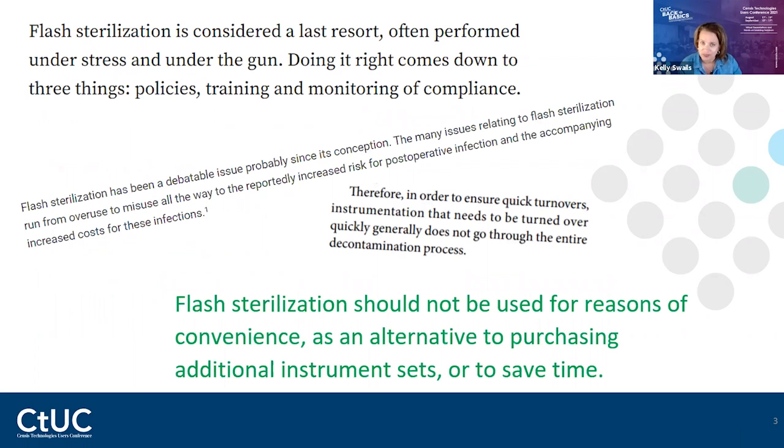For those seasoned healthcare workers like me, it was always called flash. I guarantee I will say flash throughout this presentation because it slips. Flash is just easier to say than IUSS. In 2009, flash changed to IUSS, because flash refers to an open container that is being sterilized, flashed, and then brought into an OR.